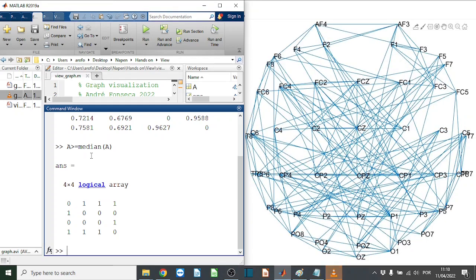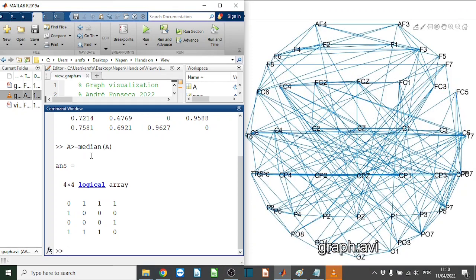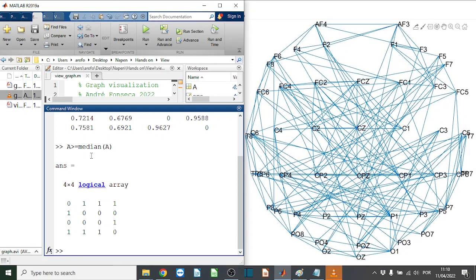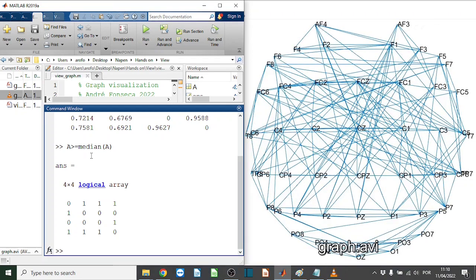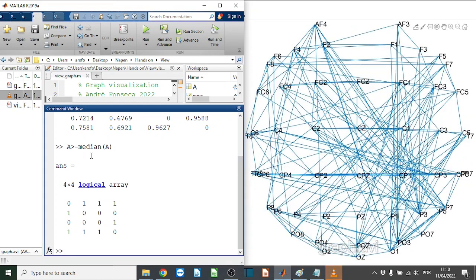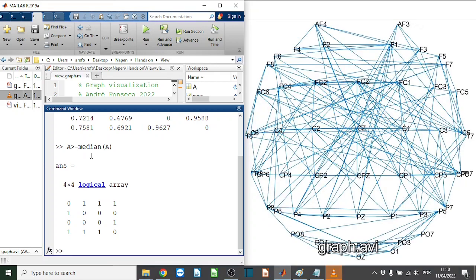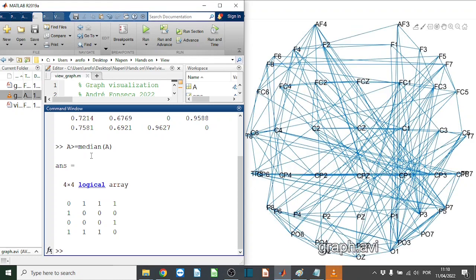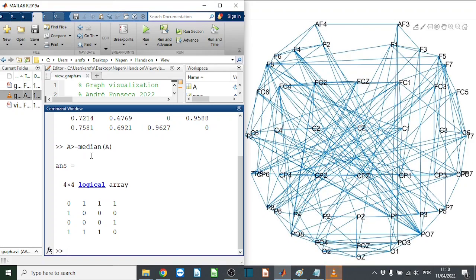It's important to notice that for each epoch of the session, the neural network changes, and the merging patterns and their shifts are fundamental to analyze the neural correlates, for instance, the ones associated with neuromodulation. So, we have a lot of information from a specific narrowband, here, delta band, of how much the channels are interacting through a connectivity measure.